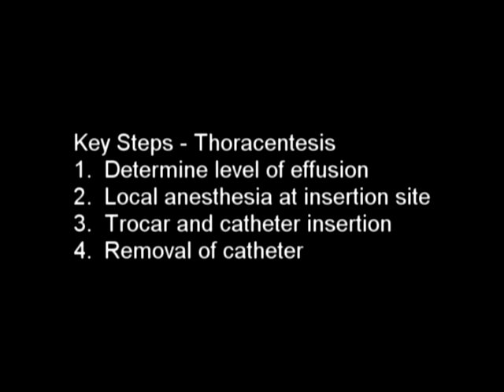Key steps: thoracentesis, determination of level of effusion, local anesthesia at insertion site, trocar and catheter insertion, removal of catheter.